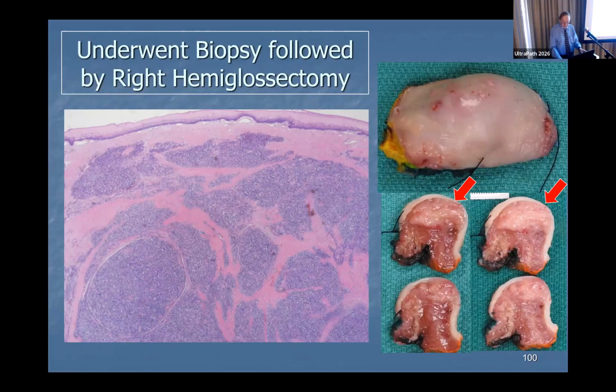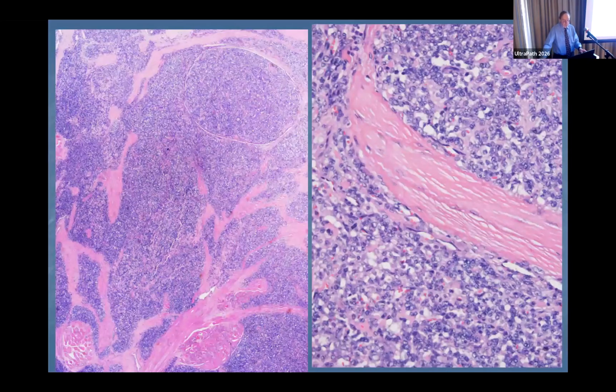And you see this very cellular type of infiltrate below that's separating the skeletal muscle there. Again, this is the same type of imaging that you saw, with large aggregates of tumor cells, and separating between them is muscle and some connective tissue. As you know, the tongue has a lot of skeletal muscle, with very dense fibers that allow you to roll your tongue, move it from side to side, and do various things with it. So it has verticalis, transversalis, and longitudinalis muscle, which have many different planes associated with them.